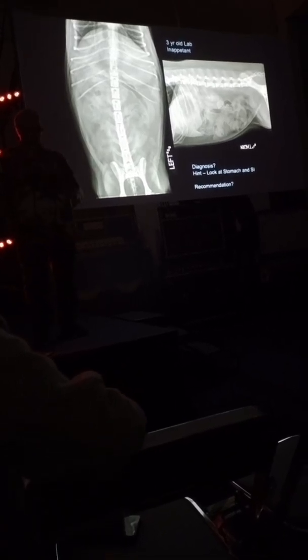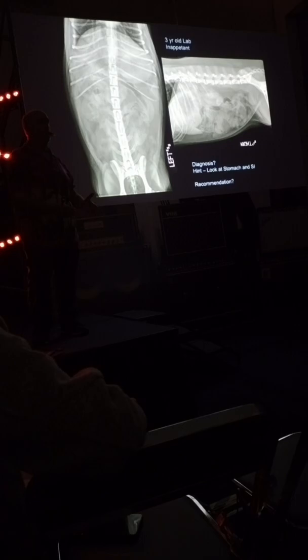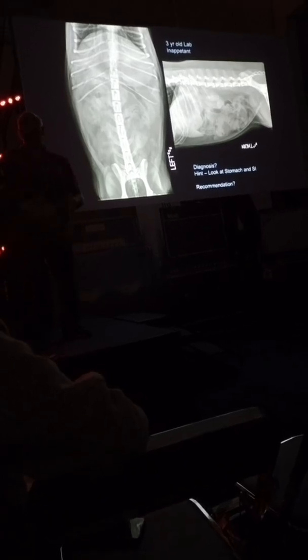Another lateral view. I'm not showing it to you, and I'm probably cheating because I want you to ask for it, because I want you to recognize how important it is. So now we go to the left lateral. Does that help you make a diagnosis in this dog that's inappetent and vomiting?